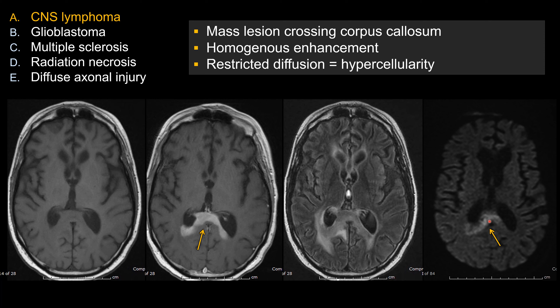There is also restricted diffusion, which for CNS lymphoma or other high-grade gliomas signifies hypercellularity. A key board exam point: CNS lymphoma has even lower diffusivity compared to GBM. The reason is that it is a small blue round cell tumor with a high nucleus-to-cytoplasm ratio, which further reduces diffusivity compared to other high-grade gliomas.